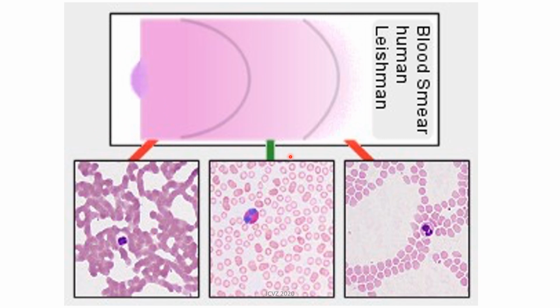If we view the tail portion or the feathered edge of your peripheral blood smear, this is how the cells would look like. The cells are not overlapping, but they are too close to each other. And then there are spaces here, big spaces. So you can see the cells, but there are spaces that should be filled with other cells. You can identify your WBC right here. If you compare your WBC here with this one, it looks identifiable as a neutrophil.